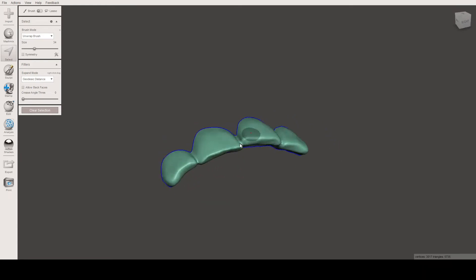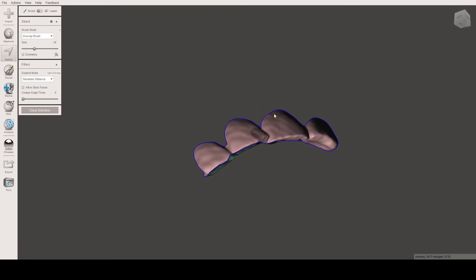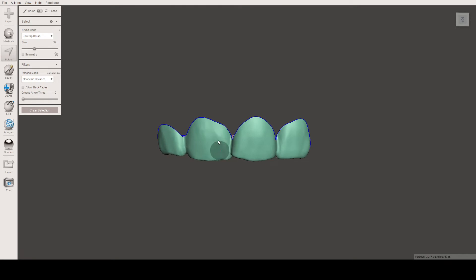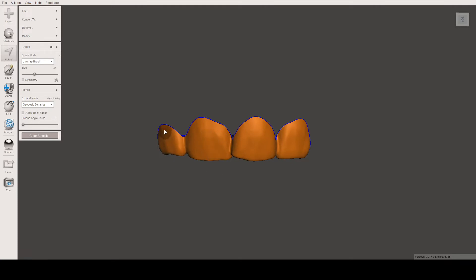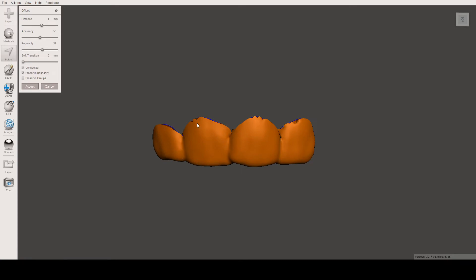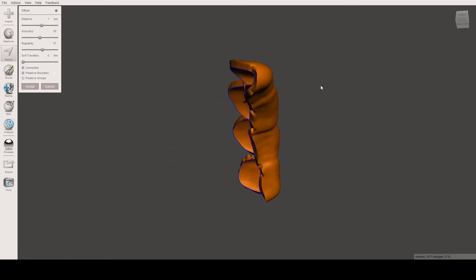However, this shell has no thickness. To add thickness, we first select the whole shell — to select a whole object, just double-click — and we press Ctrl+D, which opens the offset menu. The distance value here is the thickness we want. For example, we'll use one millimeter for the thickness, press Accept, and as you can see, we now have thickness on the shell.